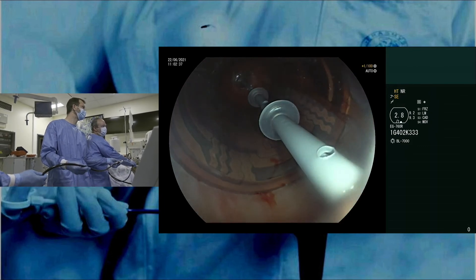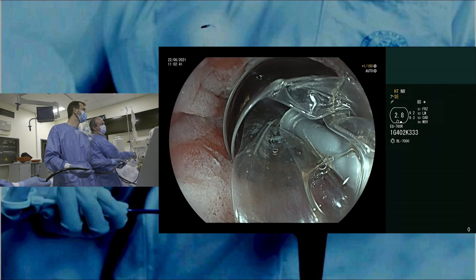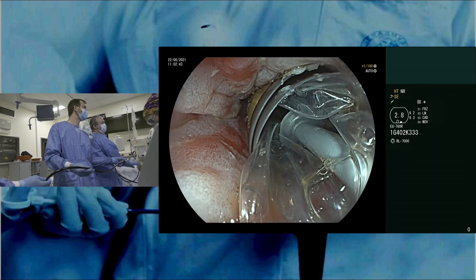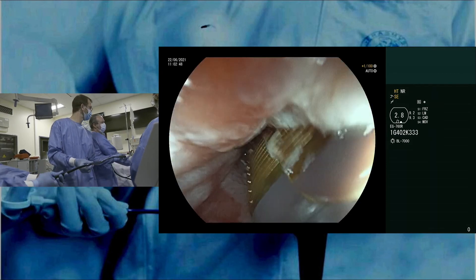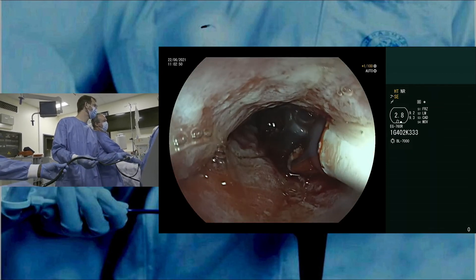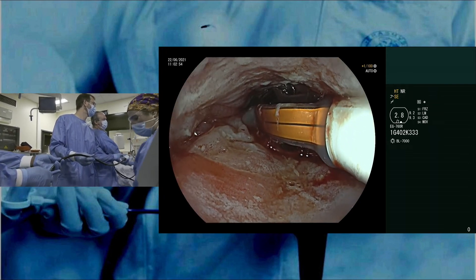In the past, we would have been stuck with an 18-millimeter balloon, giving poorer apposition in the more dilated area. So we turn it again — always when you turn, you have to come back. I always like to have the wire at the three o'clock position, so if you can just twist it a little bit more.